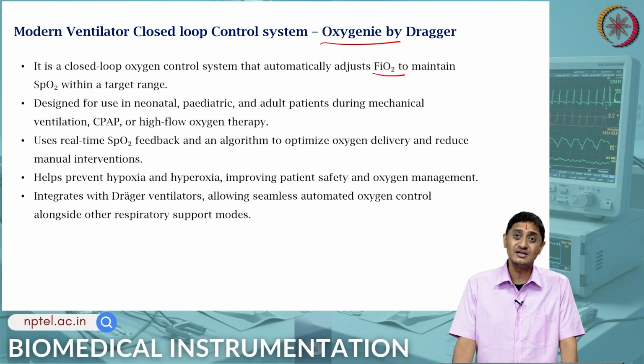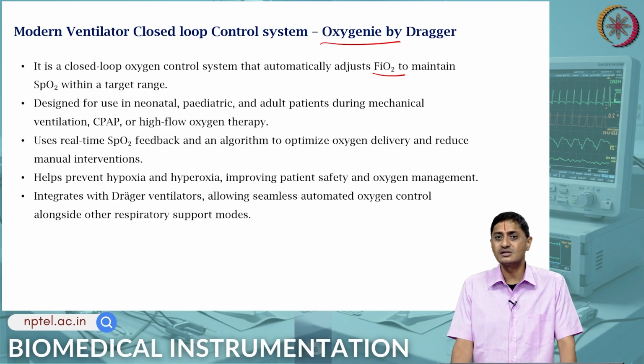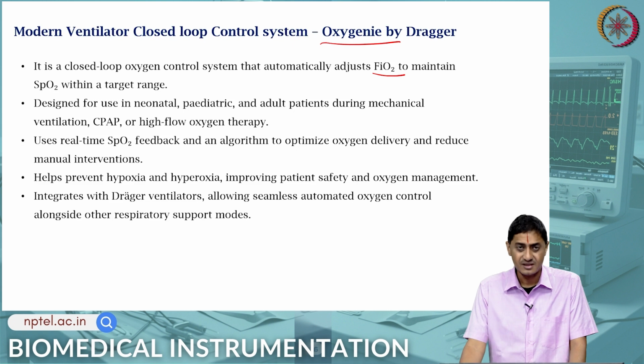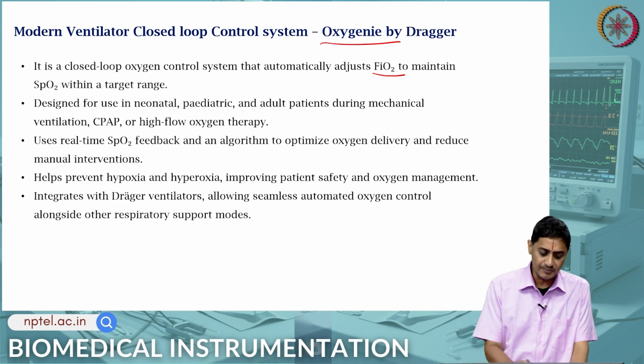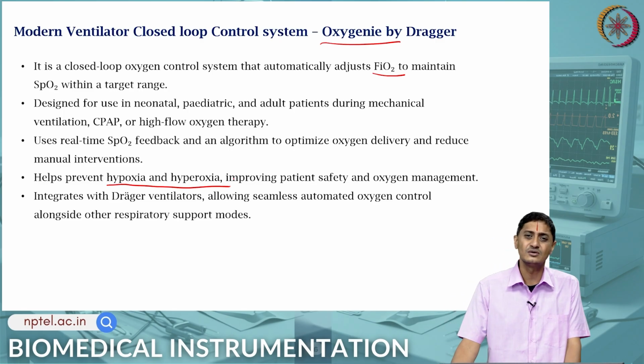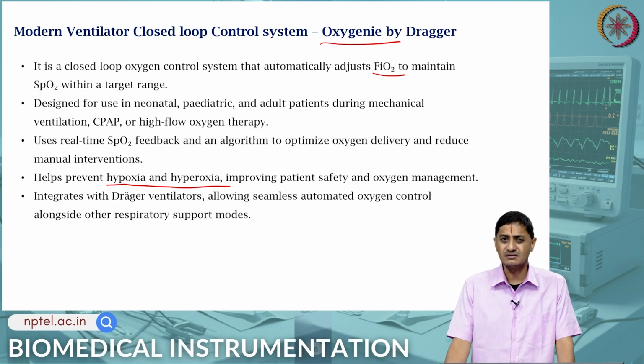This technique uses real time SpO2 feedback and has an algorithm that will optimize oxygen delivery and minimize the amount of manual interventions. This will prevent both hypoxia and hyperoxia. Note that these two things can cause acidosis and alkalosis respectively, improving essentially the patient outcomes.